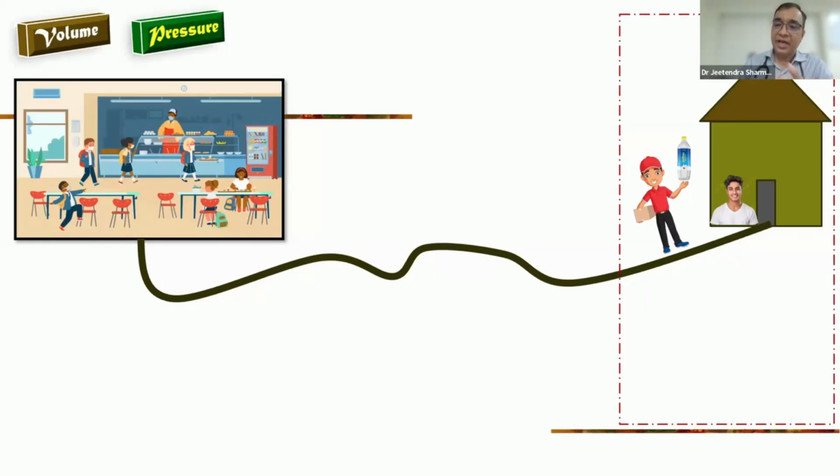And if I now come to ventilation, it is the same thing: it is control when delivery of breath is at a fixed time. When this delivery of breath is a preset of volume, it is called volume control. And if it is a preset of pressure, it is called pressure control. Okay, you understand both things. Now you understand two modes: volume control and pressure control.